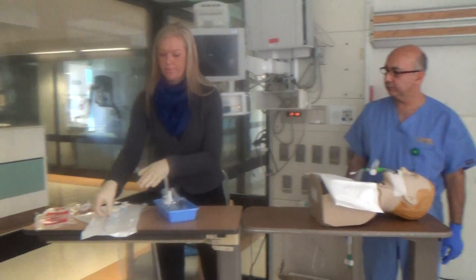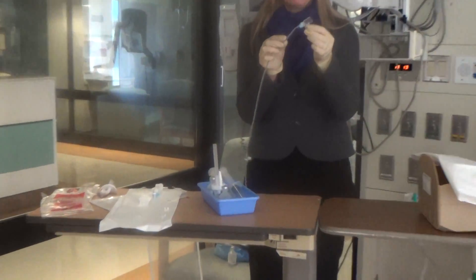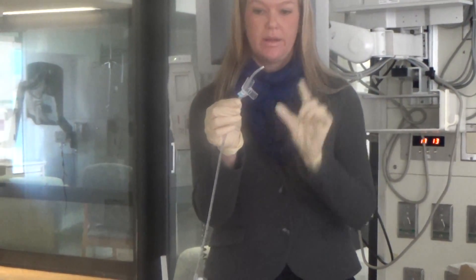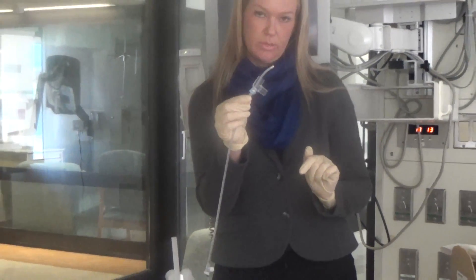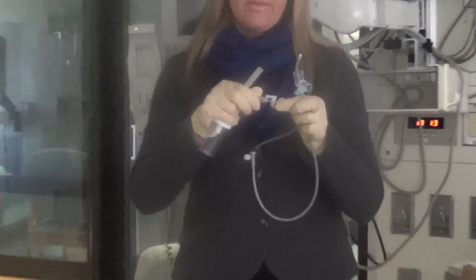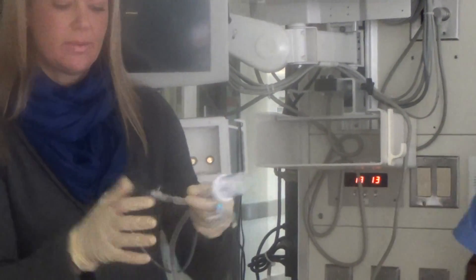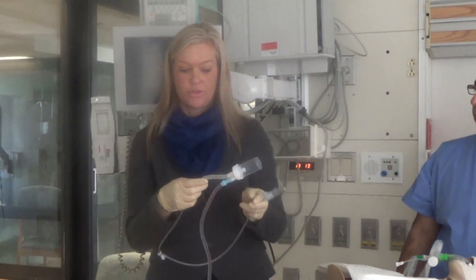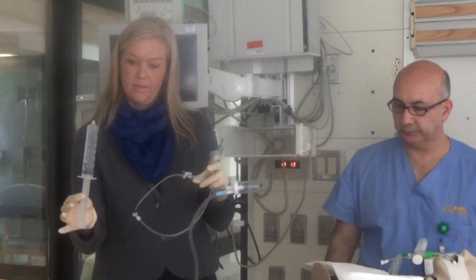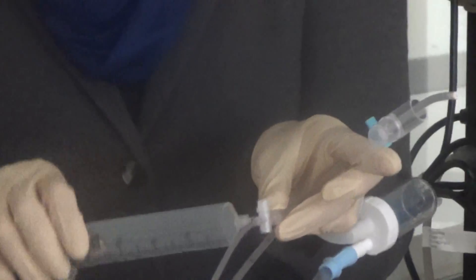We're all set to start the procedure. The first thing I'm going to do is preload my bowel cath into the ET tube adapter, about an inch and a half past the end, to prevent getting hung up on the ET tube when feeding it through. Next, I'll attach my Christmas tree adapter to the three-way stopcock, which then attaches to my Lukens trap, and then attach wall suction. I'll make sure the three-way stopcock is in the off position to suction so it does not draw saline out of my preloaded 50 mL syringes.